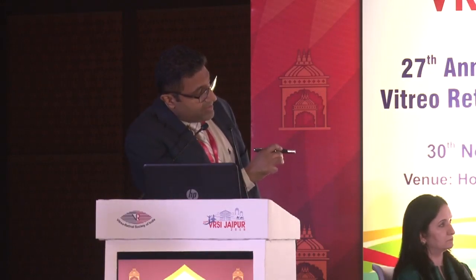What about OCT? We were interested in OCT because we had patients like this. You don't really see anything. But this patient actually has underlying progressive retinal thinning. And that's a real challenge in Stargardt's. And so we thought that segmenting the various retinal layers would be of value. We produced these kinds of maps of different layers of the outer retina. And we actually observed that, when you compared questionable to definite decreased autofluorescence, the main difference was really the relative status of the photoreceptors.